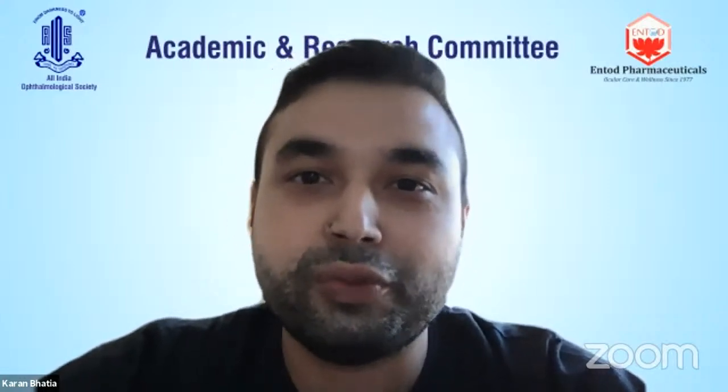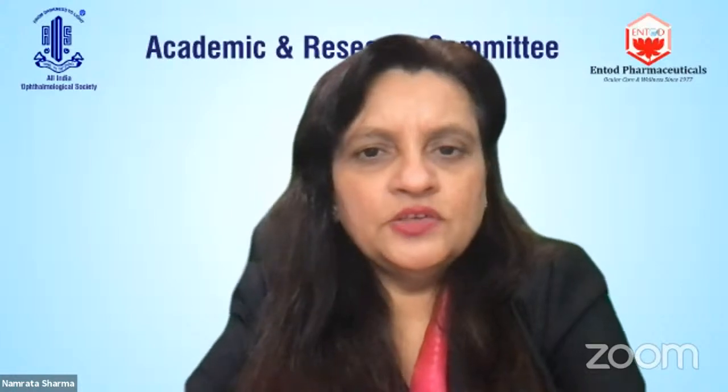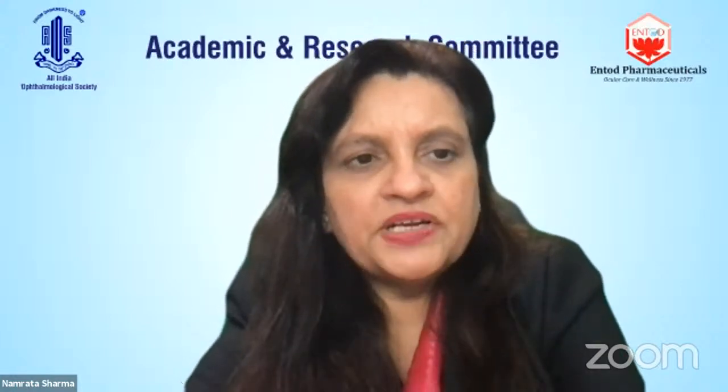Can I add one or two points actually? What I feel is the two-hand technique is an excellent thing, and the surgeon has shown that she has a lot of skill, because you can easily pull away the bag if you put a lot of pressure. We do encounter a lot of such cases, everybody does, I guess, in the CAM setting particularly. Sometimes I have seen that the micro scissors or any scissors doesn't cut it. I have sometimes cut it with a keratome knife also, which works pretty good. Sometimes it's so fibrotic, you have to put an MVR to get a small area of separation, which can then be dealt with the help of scissors.